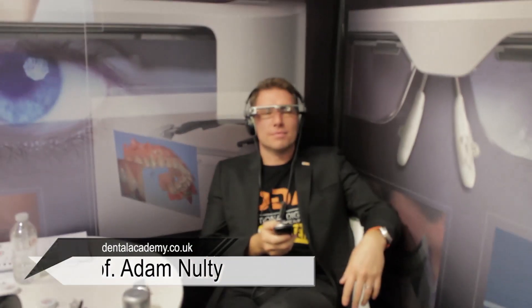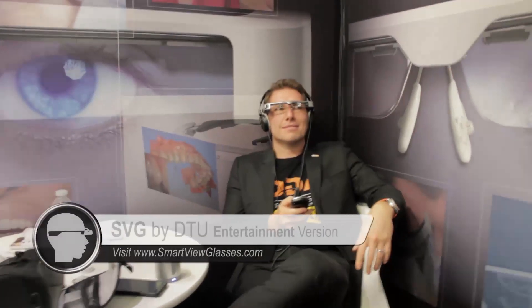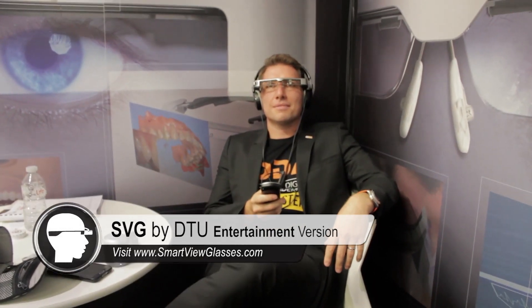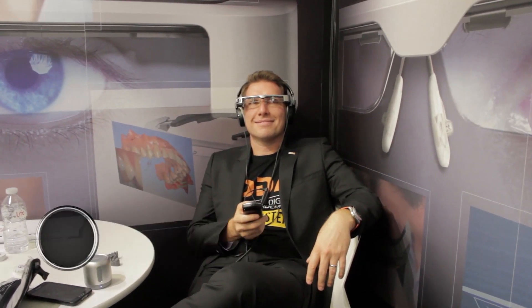You're the patient now and you need to tell me. Smart View Glass is software for dentistry — you can send audio text to the doctor during your seating. We are testing the SVG 2.0 by DTU.